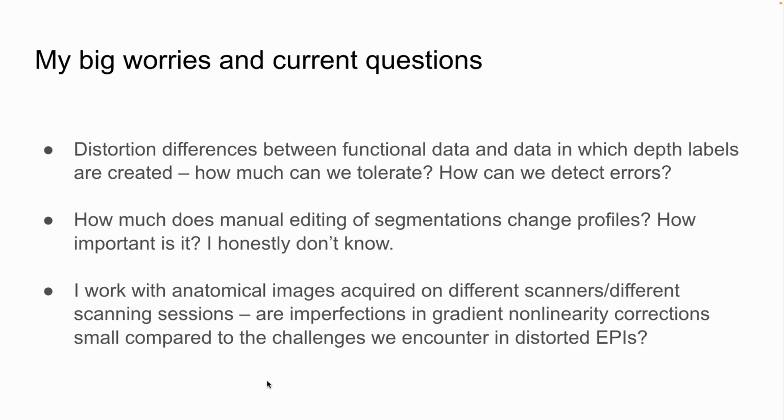But moving into this question of manual editing of segmentations, I'll show you places where it really would matter if I were analyzing that part of the brain. But in the work I'm doing, I started out, when I was a grad student, using Brain Voyager, and I did lots of manual segmentations, and all of my brains were blue. And then something would happen, and I would have to reacquire a data set or reprocess something, and I would have to redo my manual segmentations. And my life is too short, and there are so many other wonderful things to do with it, that manual segmentation was just one thing I didn't want to spend my time doing.